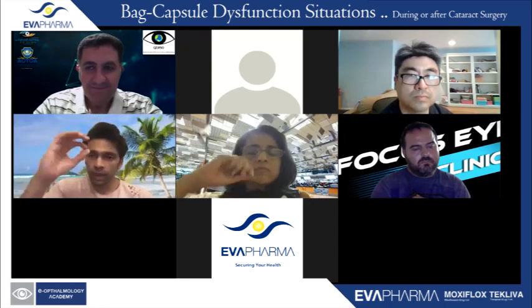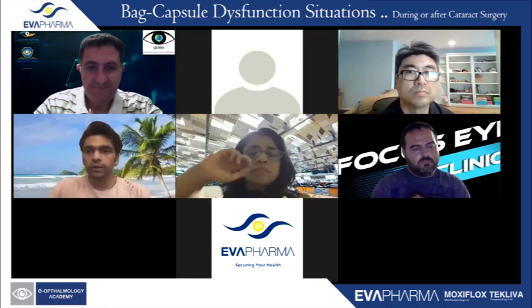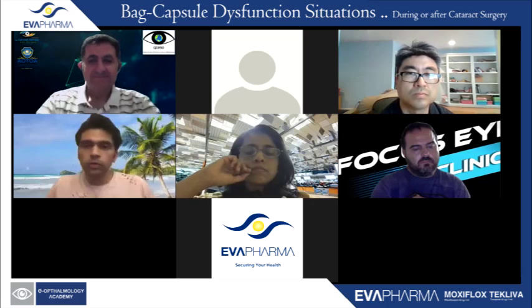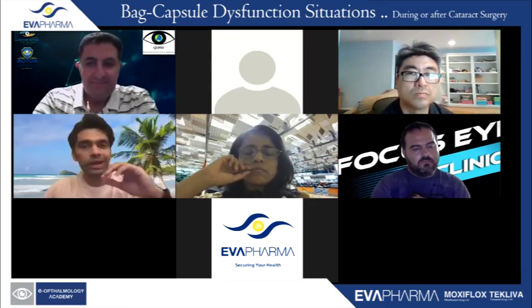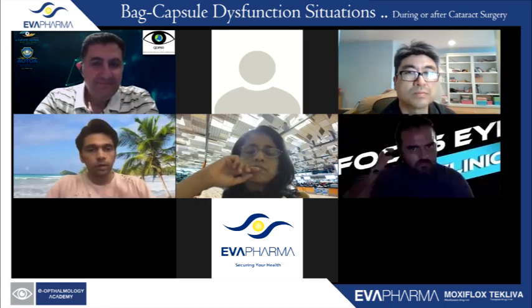So if you have an anterior capsular rim, just leave it alone. Don't try and take that off. You take the posterior, whatever you want off, just leave that anterior one. That's the one that really compartmentalizes your eye.